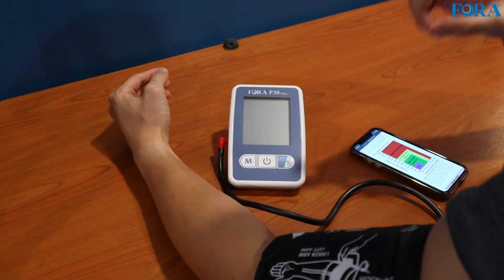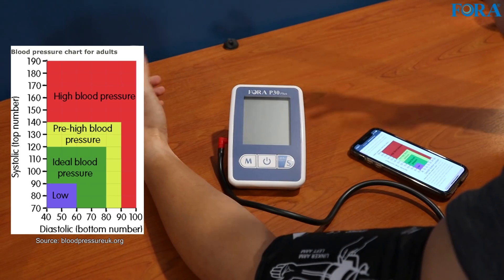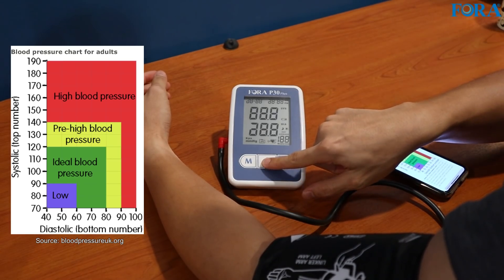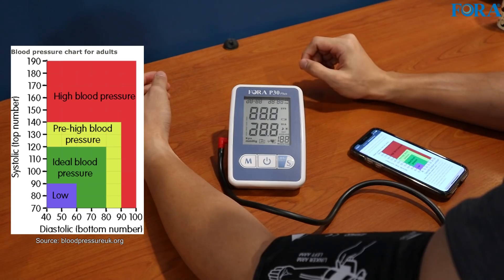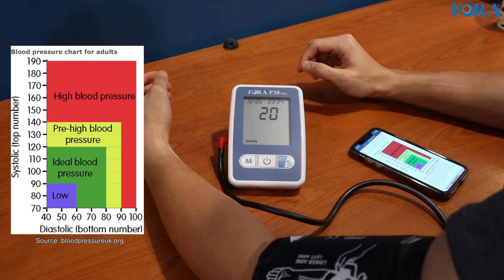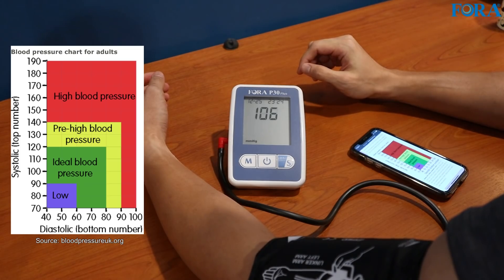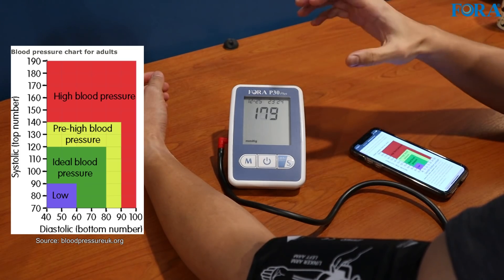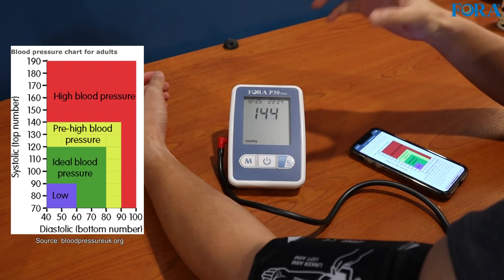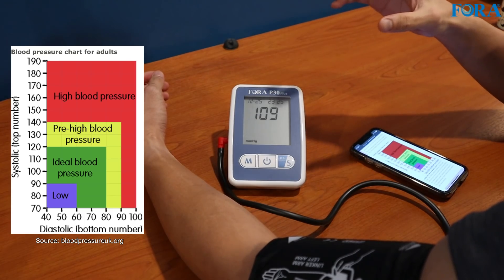I've got a chart I'll put up on screen right now of the blood pressure readings. Let's just do it — switch it on and it's gonna go. We have to hold it — that's to prevent any accidental switch-ons inside the bag, for example. I should point out that the device operates in a very silent manner. It's not too noisy, unlike other machines.